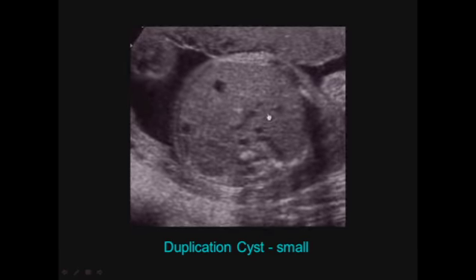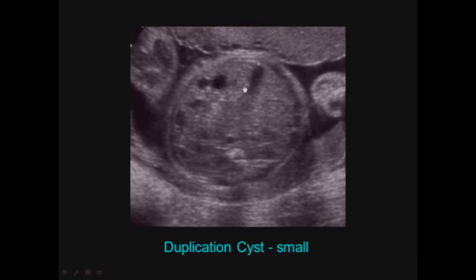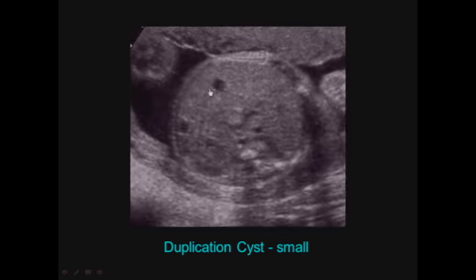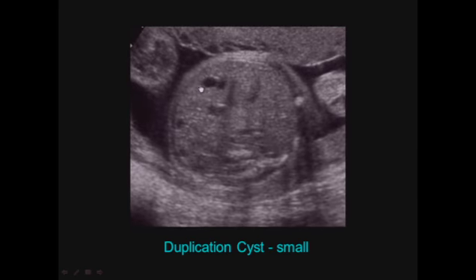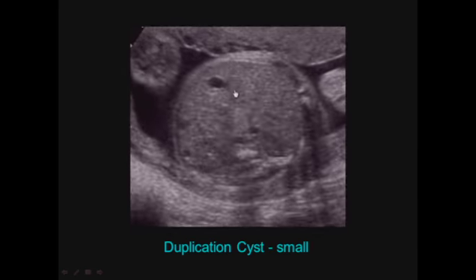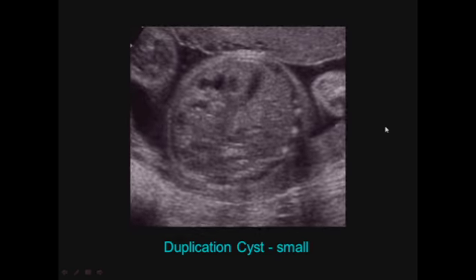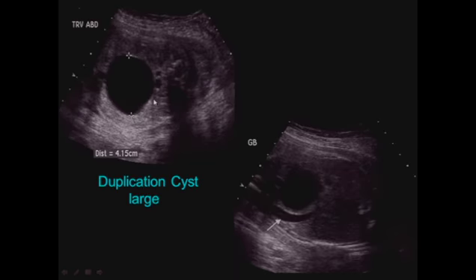This is the same fetus, just showing you a real-time clip. You can see the gallbladder, you can see the bowel coming across here, the intrahepatic umbilical vein, and this cystic structure sitting right here, closely related to this loop of bowel, consistent with a small duplication cyst. Duplication cysts can be of any size.